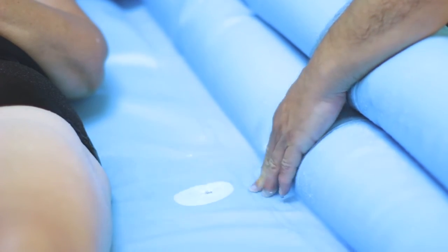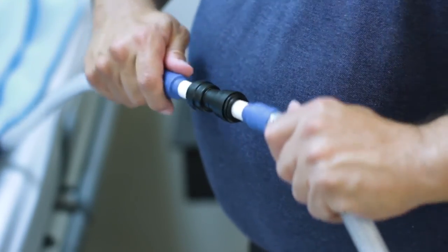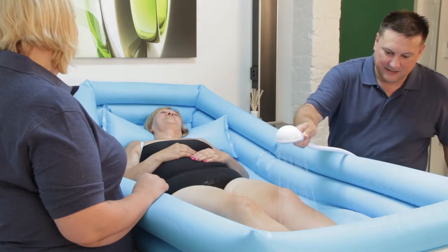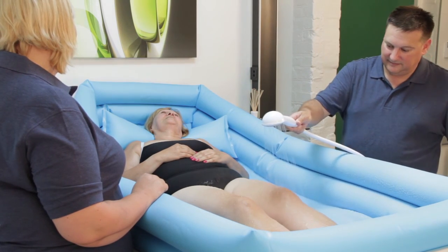If the waste pipe won't suck the water from the bath, ensure the cream filter is clean and correctly assembled. For any other issues, please return the Watergenie to your supplier for a service or replacement.